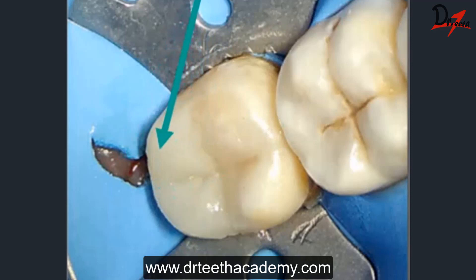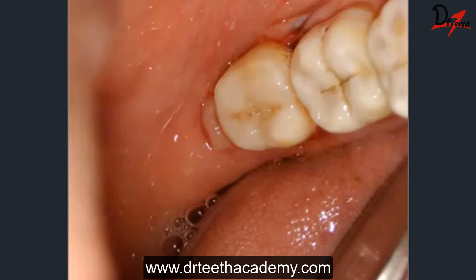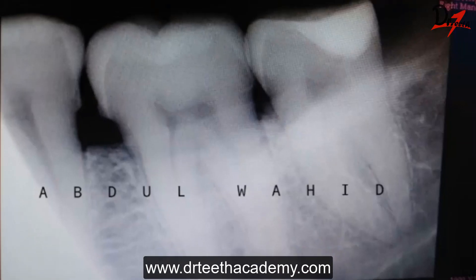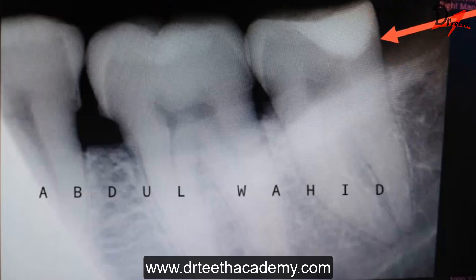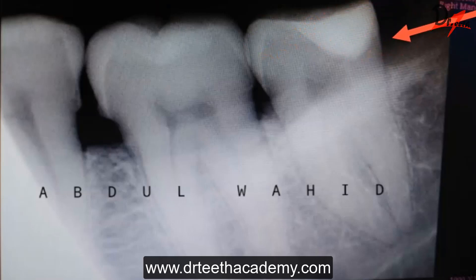The restoration is done. I finished the excess composite material with finishing discs using a slow-speed handpiece. As mentioned, I did not cut the gingiva — I simply tucked that part underneath the rubber dam to avoid bleeding and ensure patient comfort. Here is the post-operative IOPA, and I am very satisfied with the results. The restoration follows the contour of the tooth with no overhang, and it appears well merged with the tooth structure. We will be uploading more cases in the coming times.